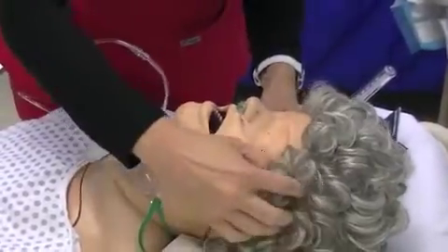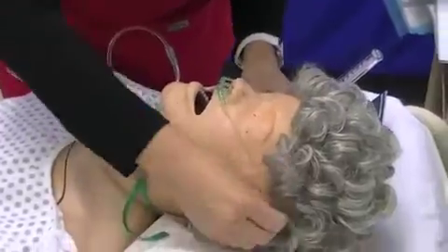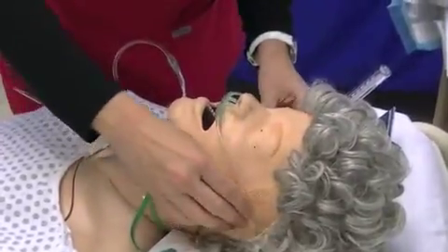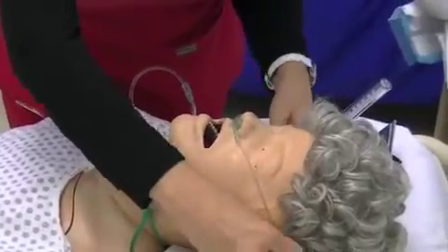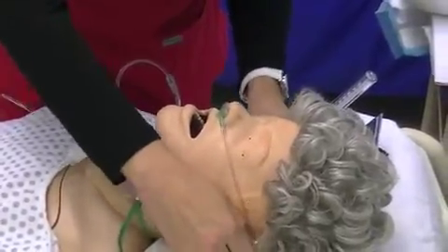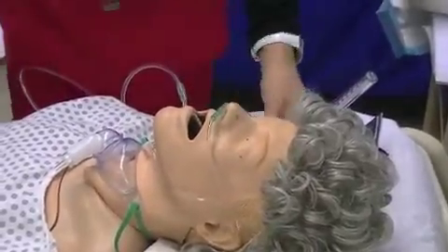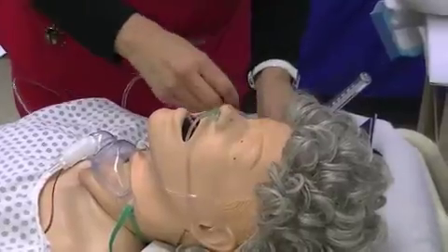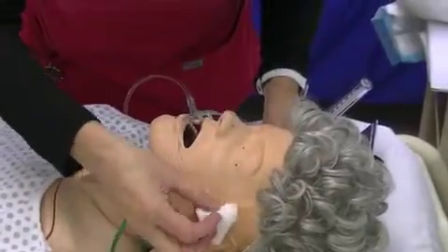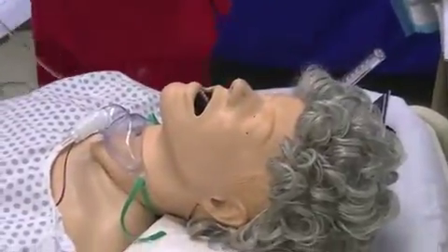Now, because it can put pressure on the ears, you can slide on these things that are cut lengthwise. It also helps protect the patient's skin from breaking down behind the ears, or you can take a couple of gauze pads, wrap it around the O2 tubing, and put it behind the ear to protect the patient's ear on both sides. So we would do that on both sides. Okay, so that's the nasal cannula.